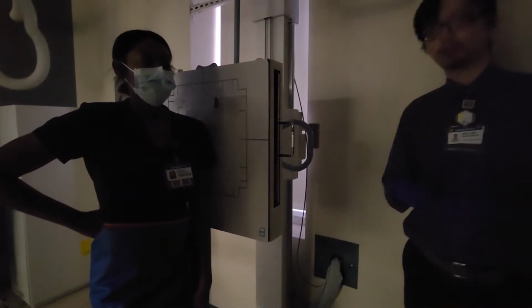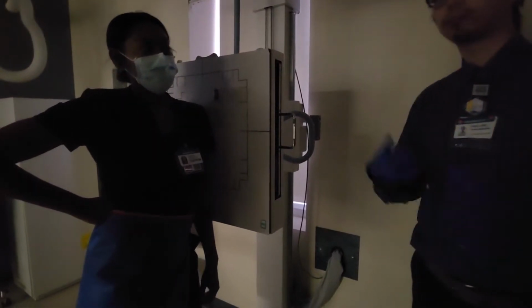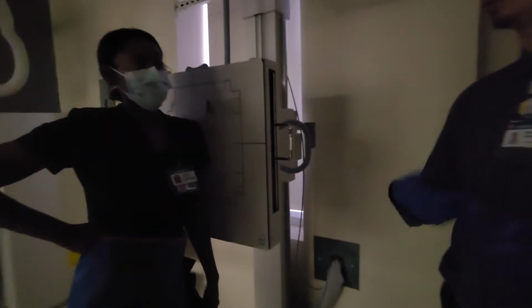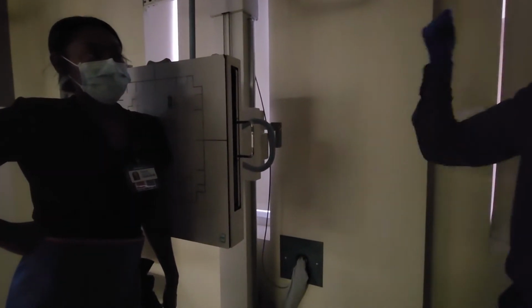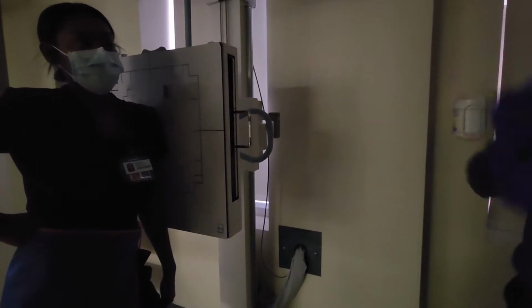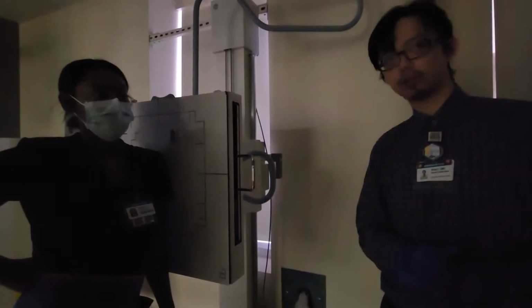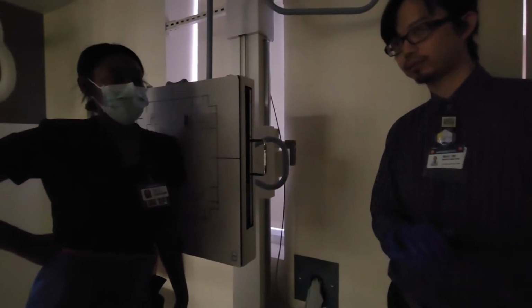So orthostatic breathing. Tell the patient, all right, I'm going to need you to take in some short, shallow breaths. So in and out, just breathe, in and out, in and out. Good, keep breathing, keep breathing, keep breathing. X-ray. Great. Relax and breathe normally. Does that make sense? Yes, it makes sense. Those are our breathing instructions for orthostatic breathing.